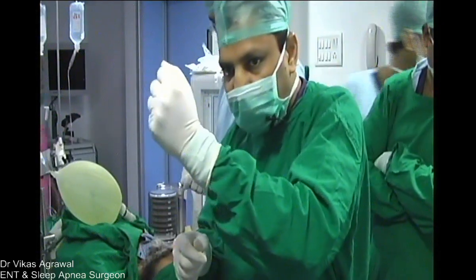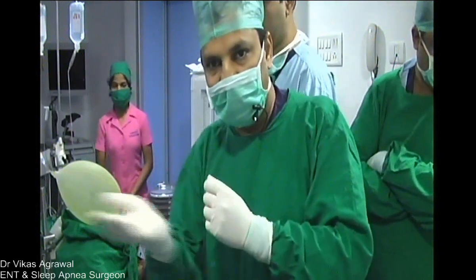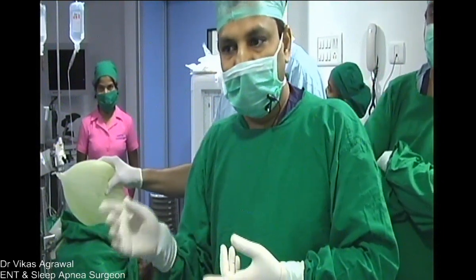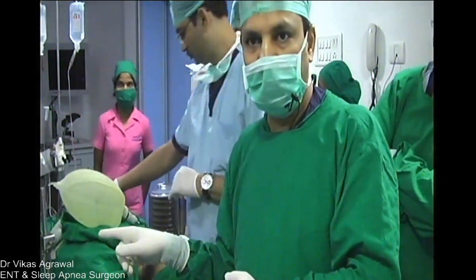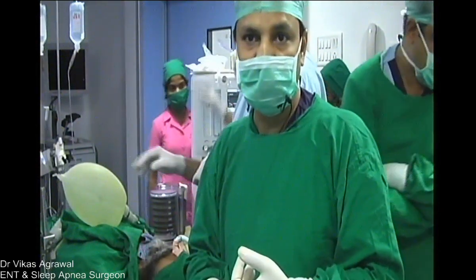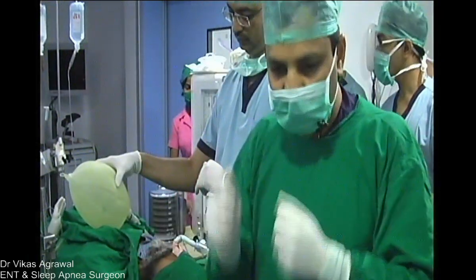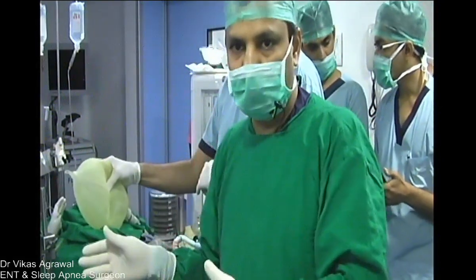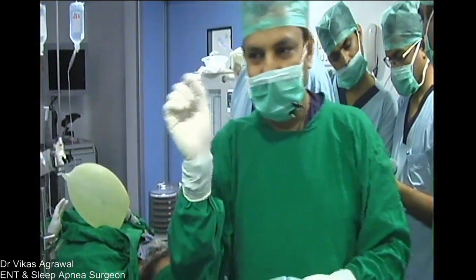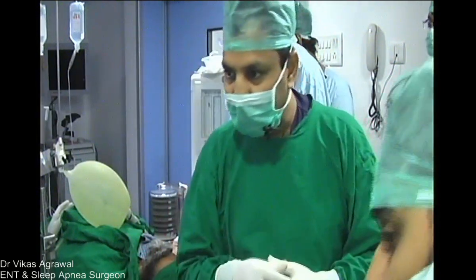If you try to put an instrument like a Macintosh laryngoscope, then that is sharp. That will go and hit into the tongue base area which we have operated. It will start bleeding again. So, if we are very sure that our hemostasis is good and it is not going to bleed, then LMA is a very safe thing. If you are not sure about the hemostasis, then you have to put in the tube. So, what I did was to make sure that there is no bleeding, at least in the immediate post-op. And in the late post-op, the chances of a big bleed are very less. It might have a little blood-tinged discharge, or a few small capillaries opening up.